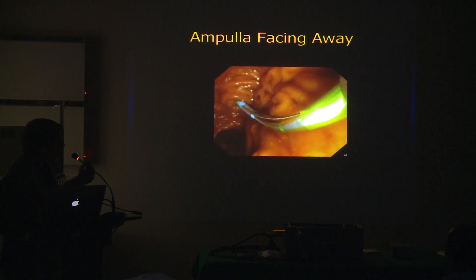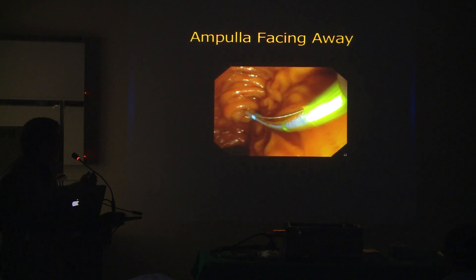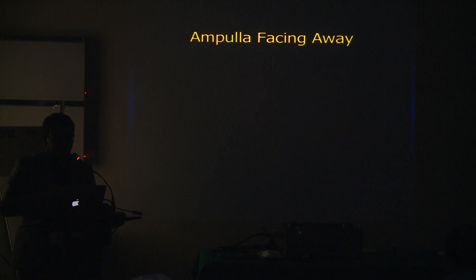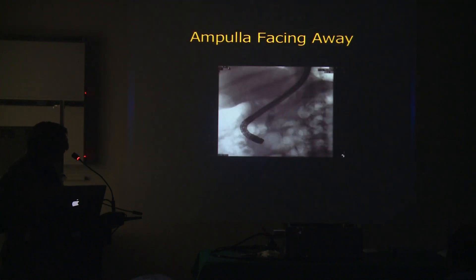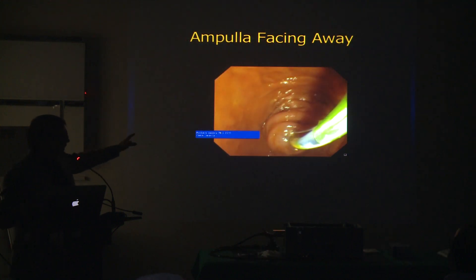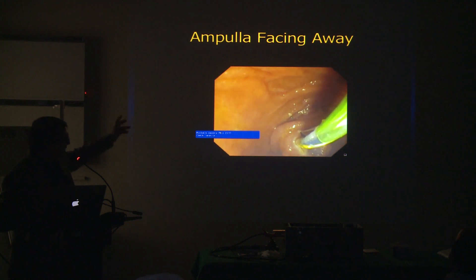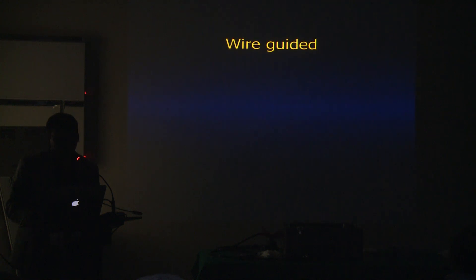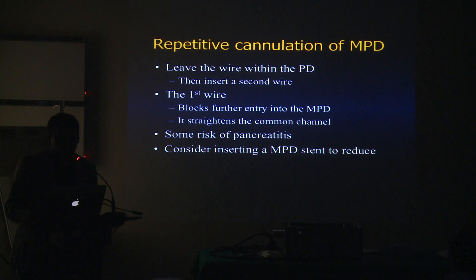I had to really bow the sphincterotome so I could engage the orifice. I'm not pushing — after engaging it, I'm trying to pull it. Until I engage and then pull it further back to straighten it, because if I keep pushing it down it would never get into the duct. There's a double wire-guided technique. When you are trying to cannulate but keep going into the main pancreatic duct, the better thing would be to just get the wire in there. Even if you've gone a couple of times into the main PD and injected it, it's best to get the wire in there and use a double wire technique.